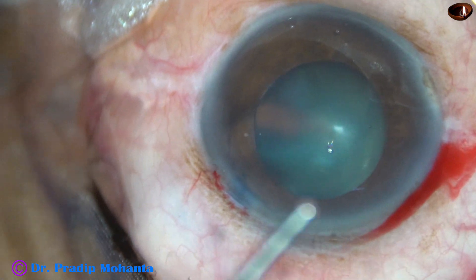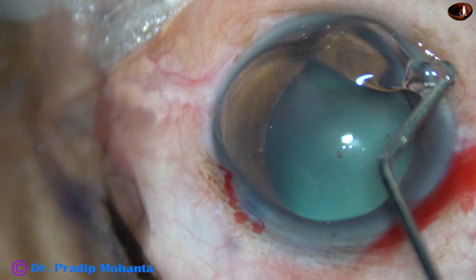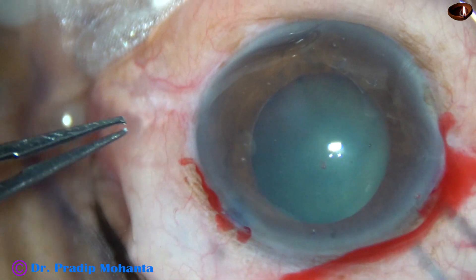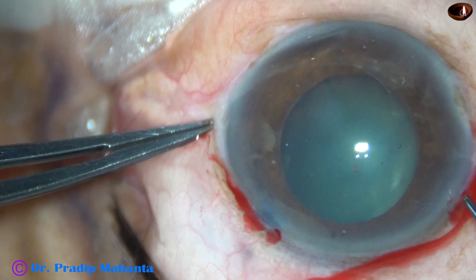Now I inject viscoelastic — I apply the viscoelastic, that is 2% HPMC, over the corneal epithelium.